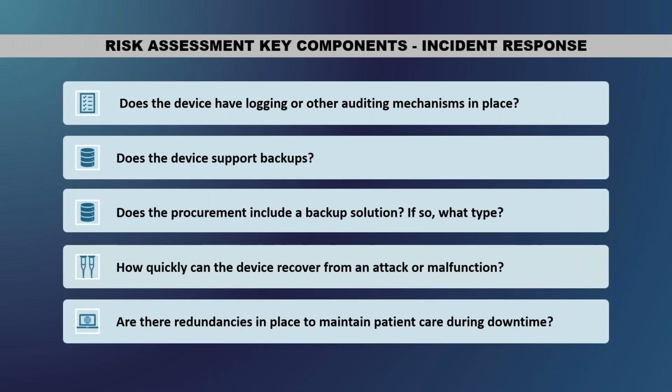And then the incident response. That's where I went through this with the vendor as well: if there is a device and you get a corrupt file or there's a data breach, how quickly are you able to get this database back up? Is there a database backup? Is it in the procurement? A lot of times the backup solutions aren't part of the procurement. So how are you going to protect the data? Do you have to procure another solution? How quickly can you recover from an attack?